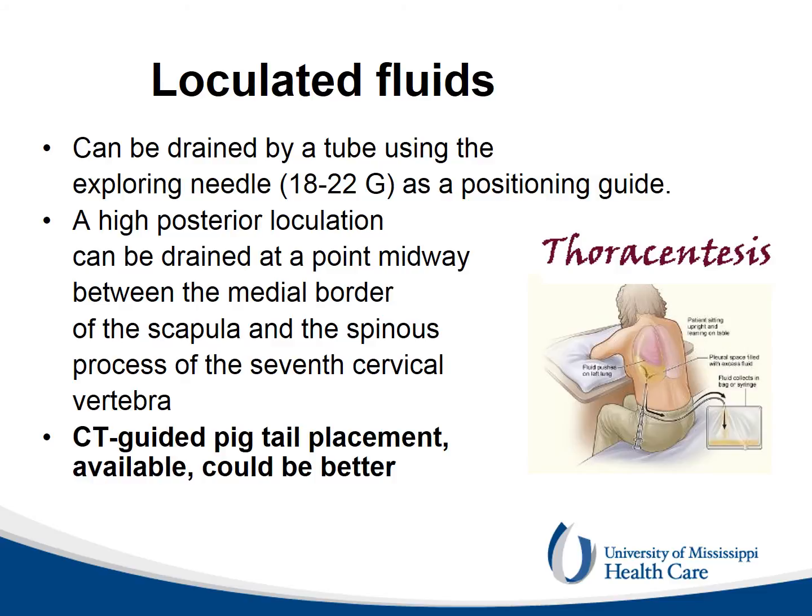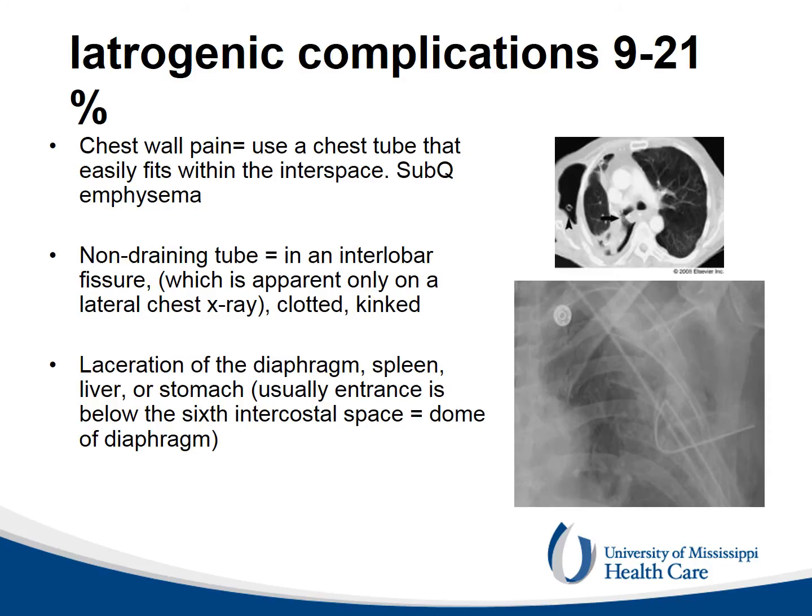A loculated fluid collection can be drained at the bedside based on a chest X-ray and clinical findings. It can also be drained by the interventional radiologist with the help of the CT scanner. Iatrogenic complications of chest tube insertion are still possible as a result of poor technique.